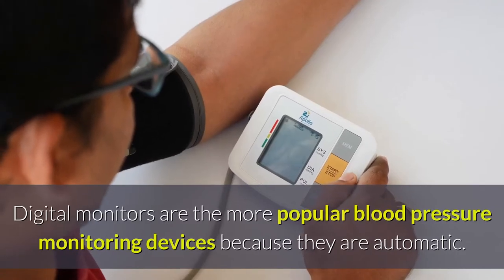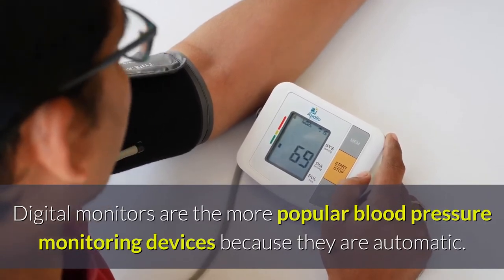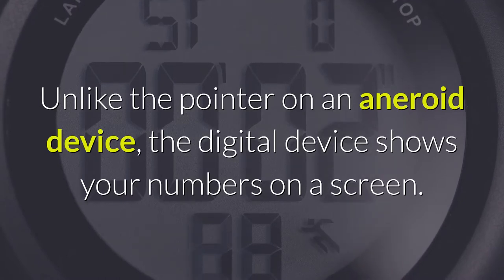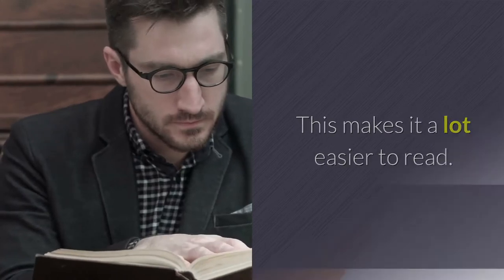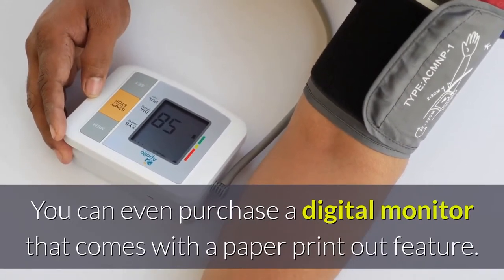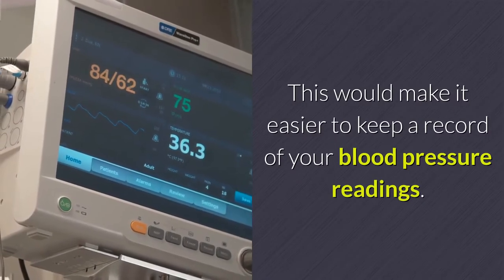Digital monitors are the more popular blood pressure monitoring devices because they are automatic. Unlike the pointer on an aneroid device, the digital device shows your numbers on a screen, which makes it a lot easier to read. You can even purchase a digital monitor that comes with a paper printout feature, which would make it easier to keep a record of your blood pressure readings.